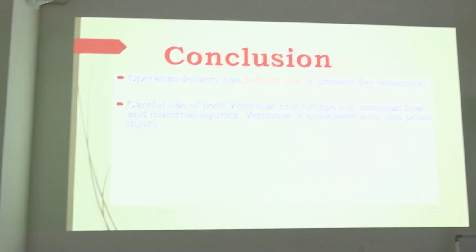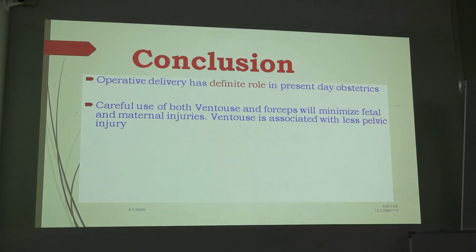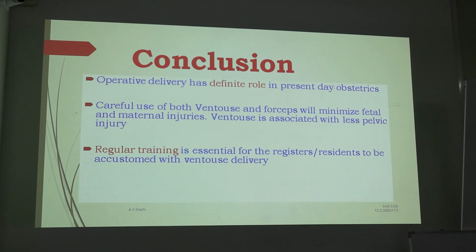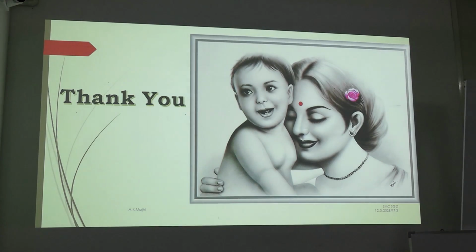এটা কনক্লুশন: অপারেটিভ ডেলিভারি হ্যাজ ডেফিনিট রোল। Careful use of both ventouse and forceps will minimize fetal and maternal injuries. Ventouse is associated with less pelvic injury. Regular training is essential. Thank you.